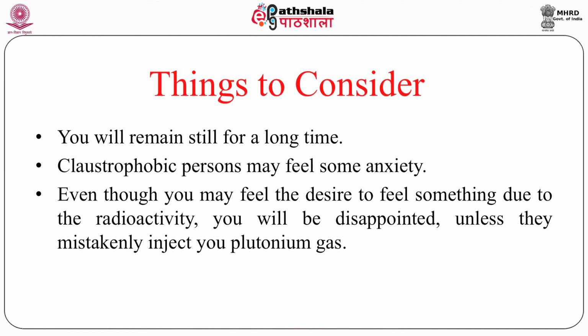Even though you may feel the desire to feel something due to the radioactivity, you will be disappointed unless they mistakenly inject you with plutonium gas. Usually when we take a normal crocin, we do not feel anything. But if someone says radioactivity is going to be administered, you start feeling that something is happening, though nothing happens unless you are injected with plutonium gas.